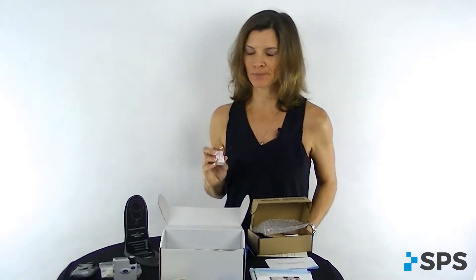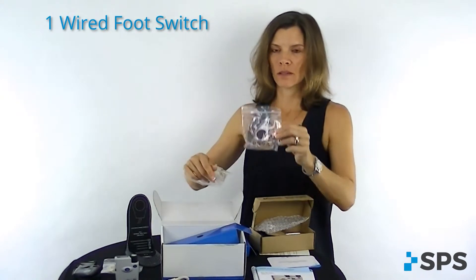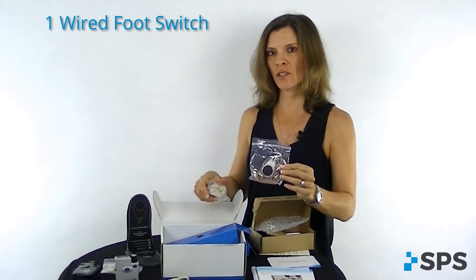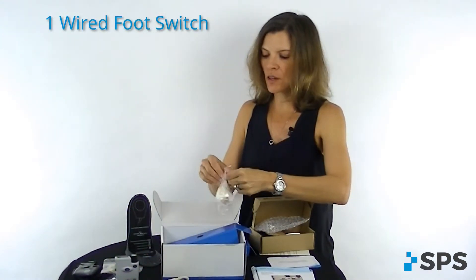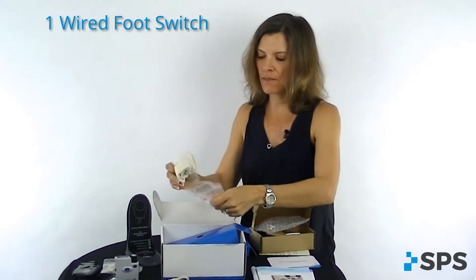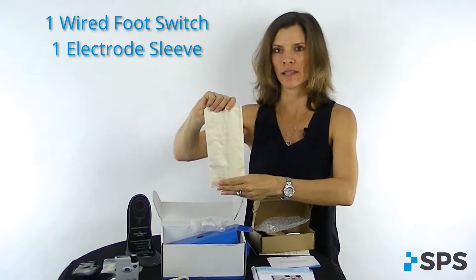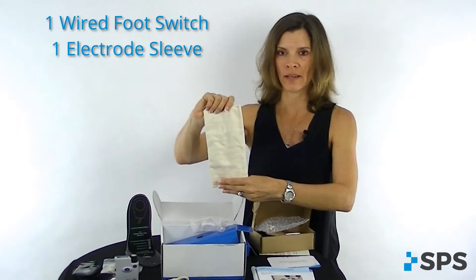It's okay to use an everyday non-rechargeable battery — just don't try to put those batteries in the lithium ion pro charger. The last couple of items in your kit are going to be a wired foot switch. This would be for use when patients are on airplanes or in situations where they cannot use a wireless foot switch. And also the sleeve that fits over the electrodes so that your patient has coverage, making sure that air doesn't get to the electrodes and that the electrodes don't stick to clothing or fall off during the day.